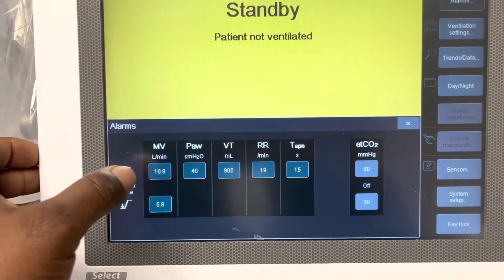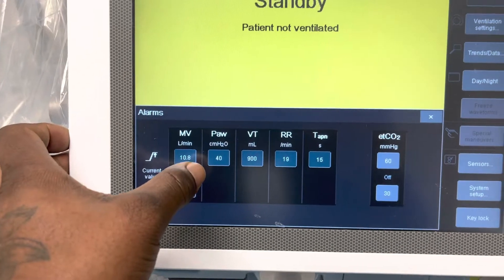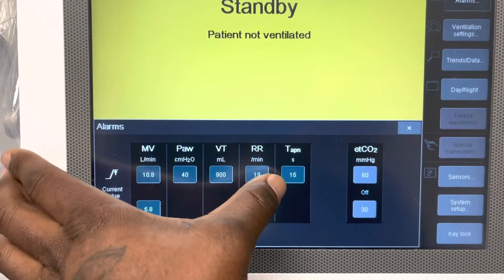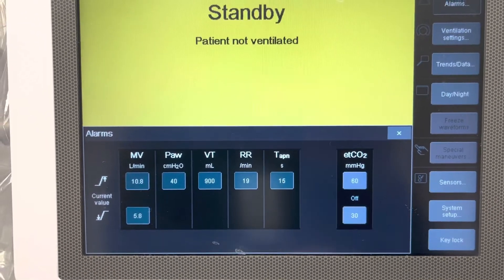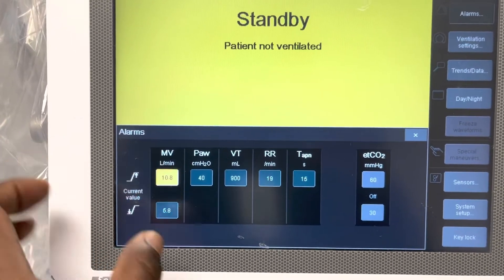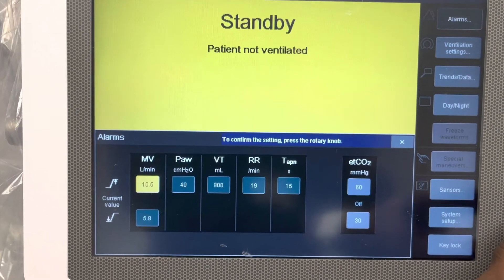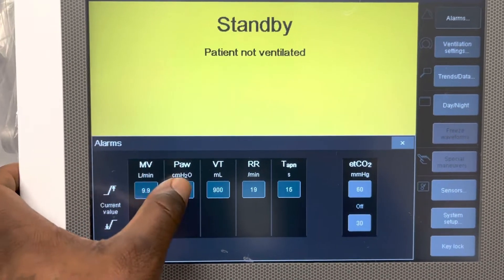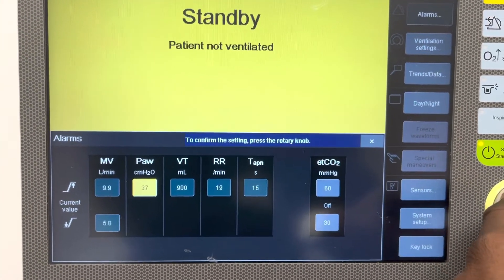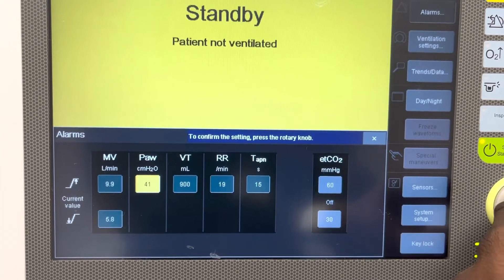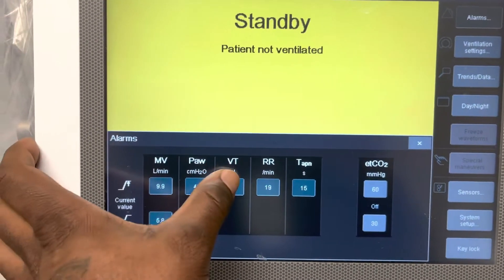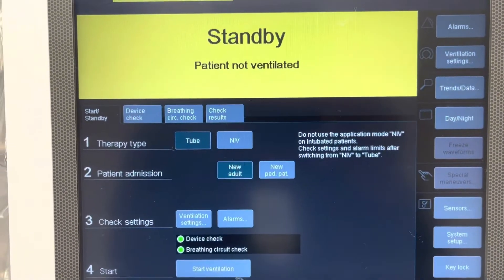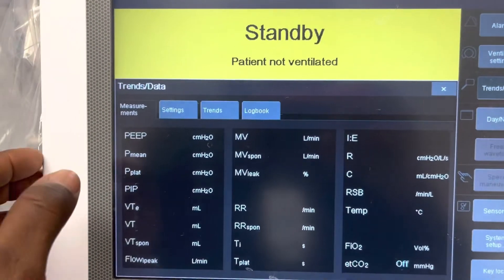The alarms used in ventilation include high and low pressure, tidal volume, respiratory rate, and tidal CO2. You can adjust the alarm parameters by twisting the knob and pressing the button. For example, high pressure around 40 is about right. You can adjust tidal volume and see all alarm parameters.